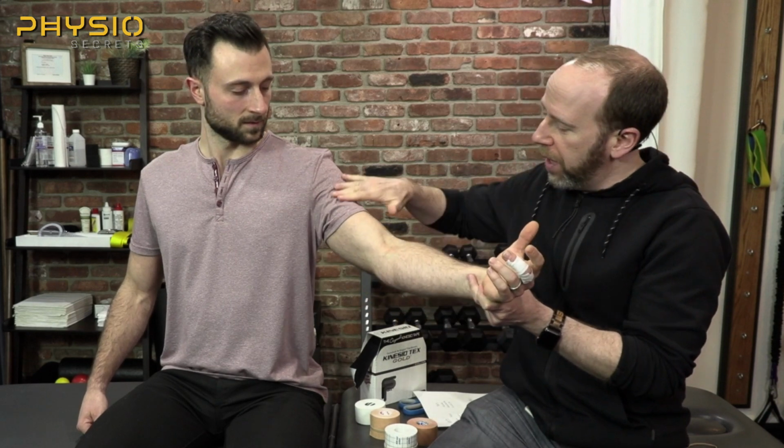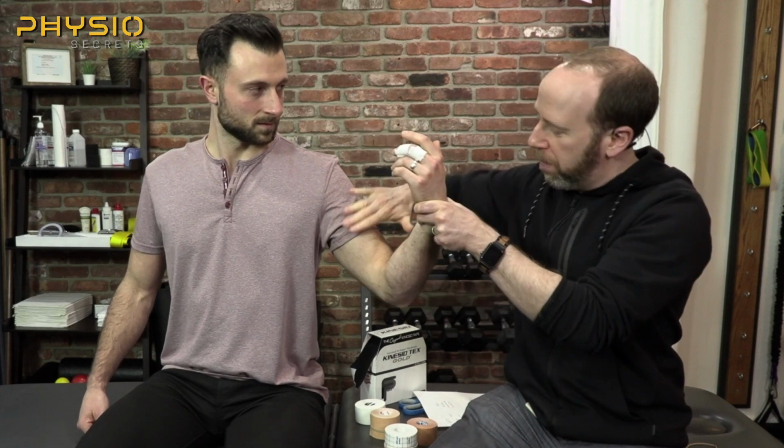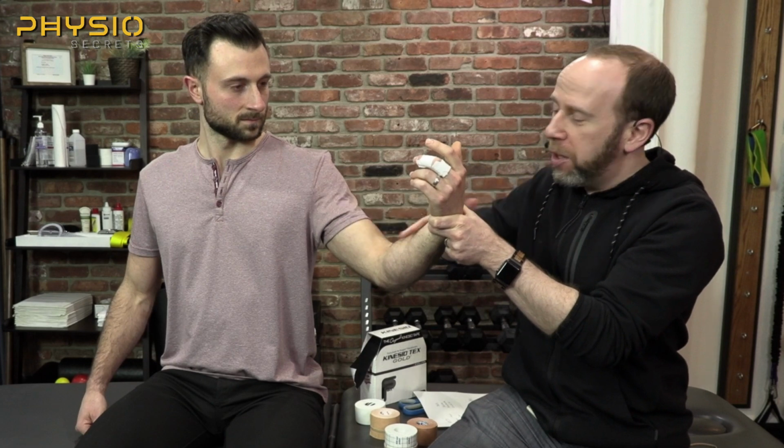A lot of people think that it's just the tape tension that matters. No, as you put the tape on, it's how hard you pull the tape. But it's not. It's mostly the preposition of the arm. So if I put his arm in this position and I tape, you'll notice that the tape is going to go on stretch only when he gets into full extension. But if I put him in this position and apply the tape, it's going to go on tension when I'm here.